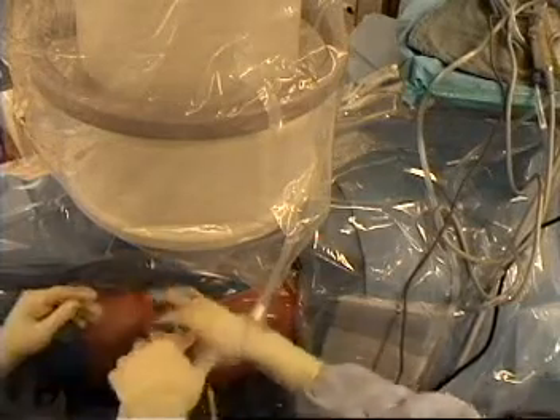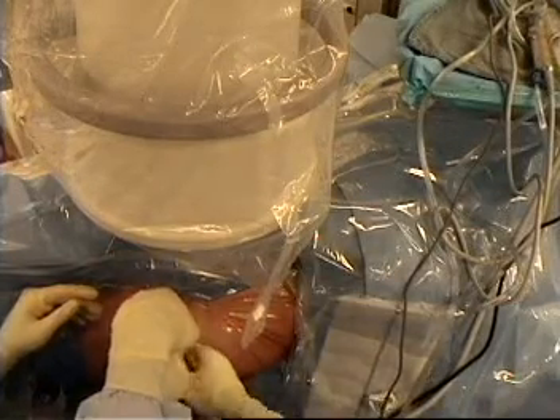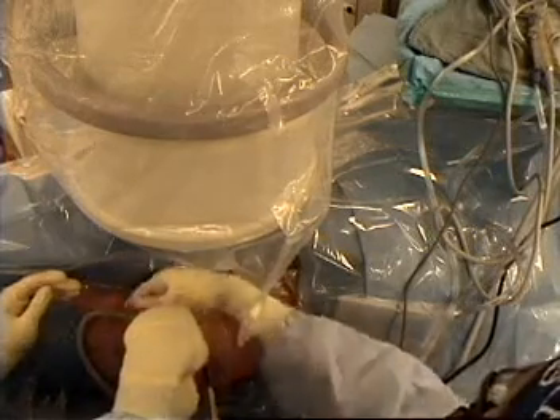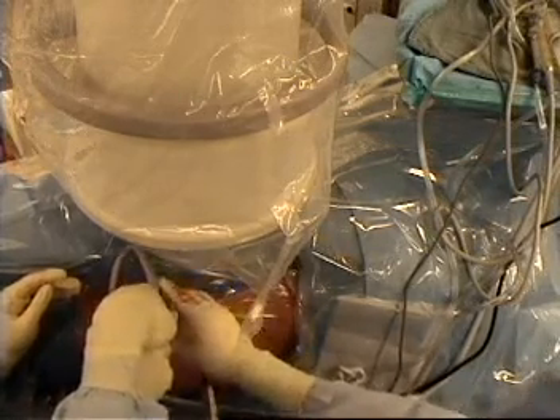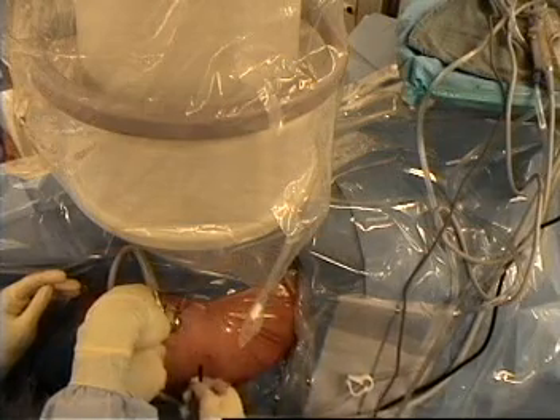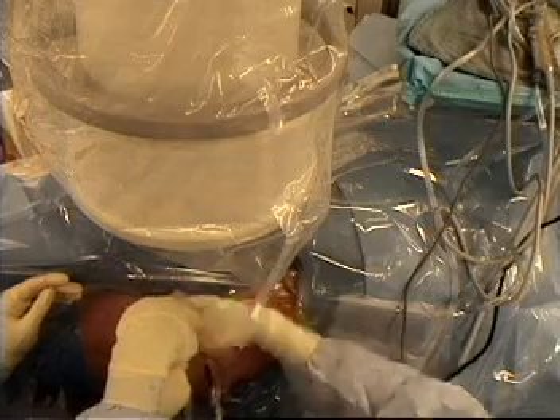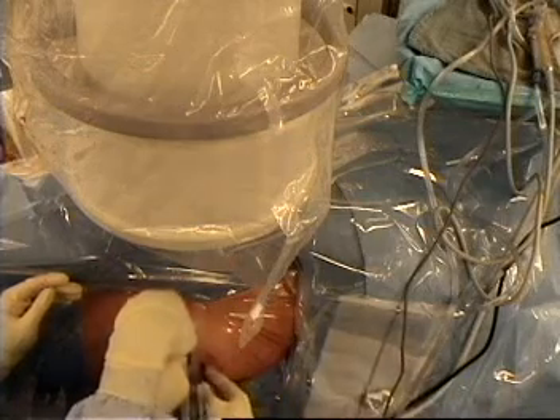We are going to look all the way around the top. Actually, this is the best part — you can actually see where it is trying to heal. It is almost healed. I just want to see if that is stable. We want to look up here. This is where you actually have another labral tear, at the very top.